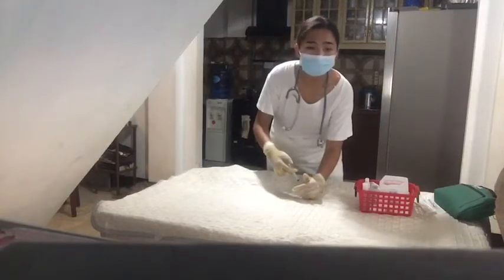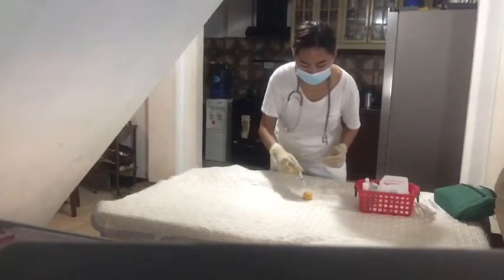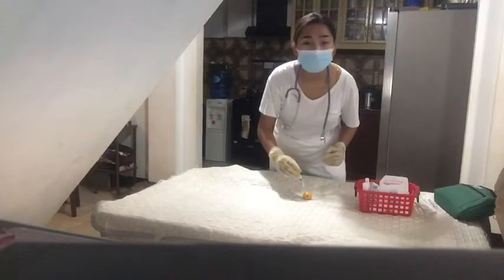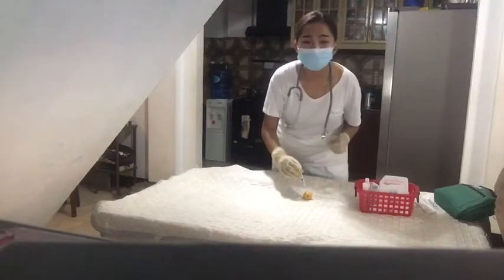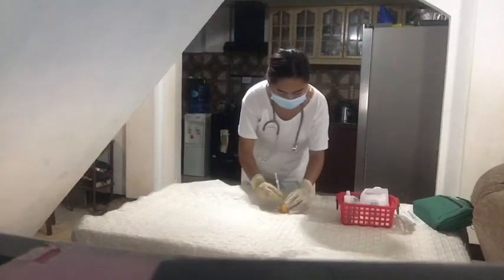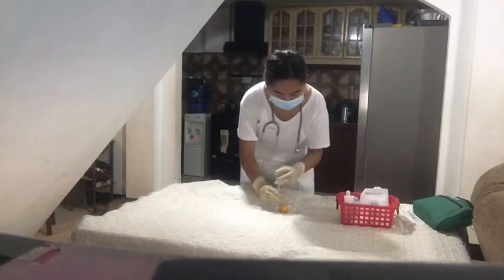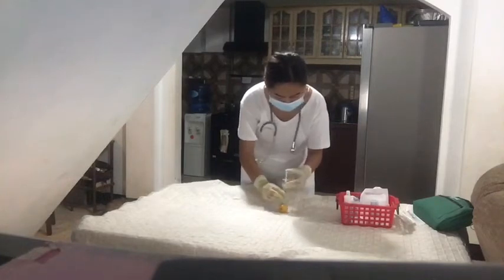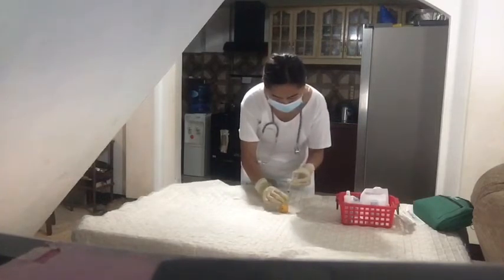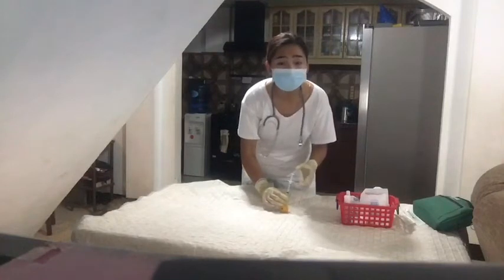And after that, we'll now release the skin, to avoid injecting into the compressed tissue. After which, we'll hold the barrel of the syringe steady with your non-dominant hand.